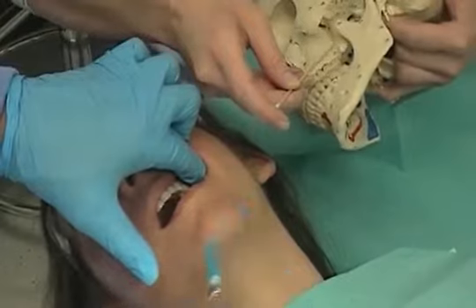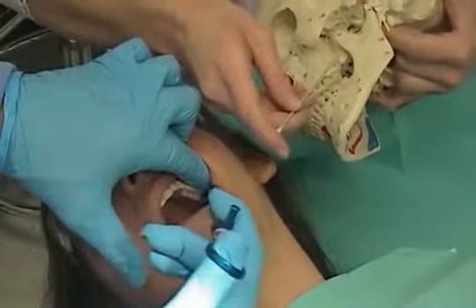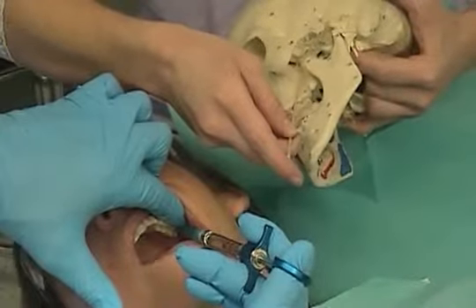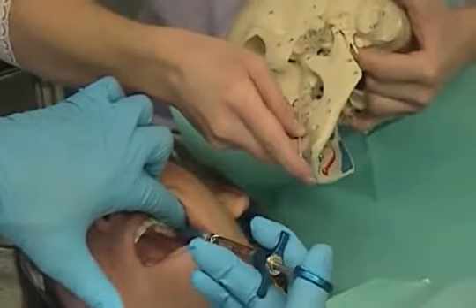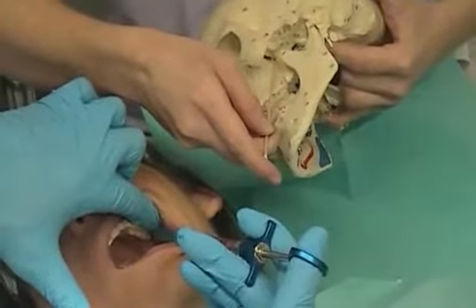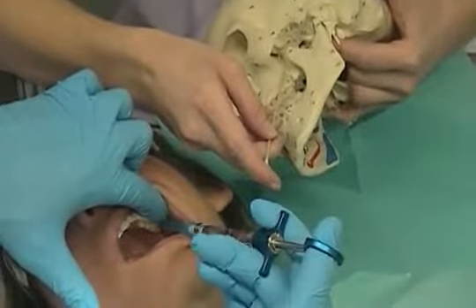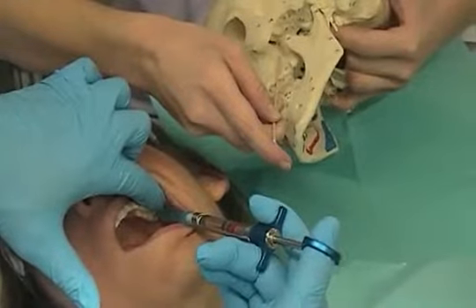because, again, with a patient with a third molar requires a more posterior approach. Once you've done this, the basic idea here is to have a three-direction approach in one movement. In other words, we want to go up, back, and in, all in one motion. Again, the book indicates 45 degrees in one plane, 45 in another. And if you approach the target site with this in mind, you will have incorporated those three directions, up, back, and in, all in one motion, like so.